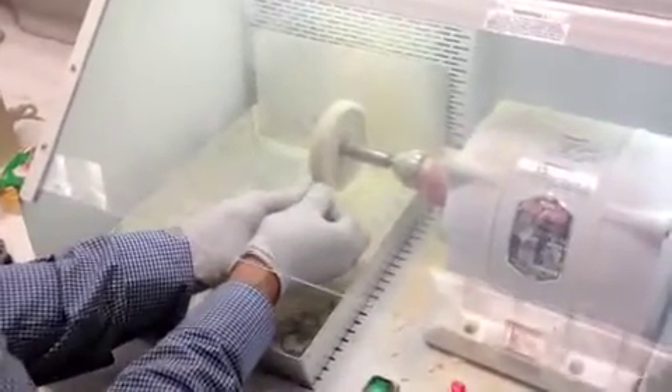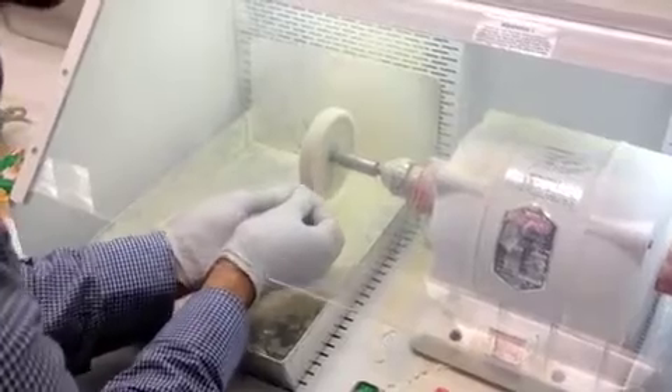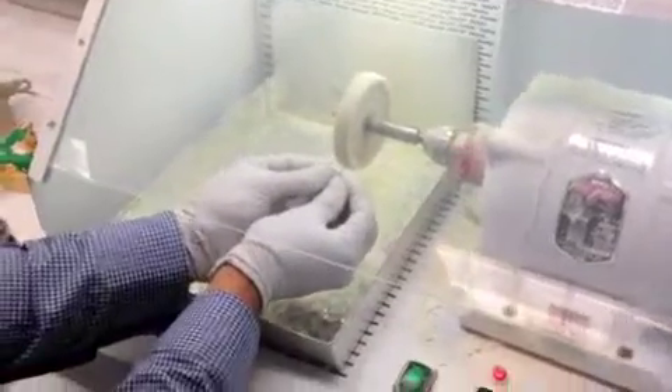All you have to do is go against the buff wheel. Make sure you hold your crown with two hands, with all your fingers, so that it doesn't fly away. Just touch it nicely against the wheel and you will see that it's going to shine. And that would be perfect for your crown.